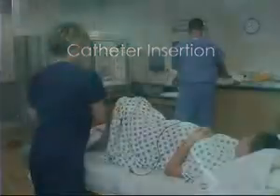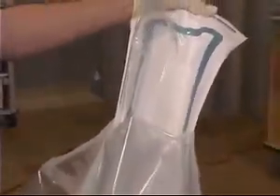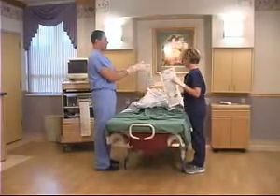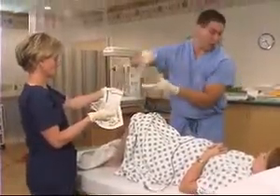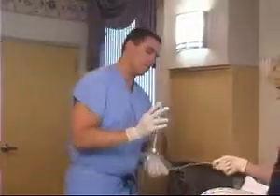Open the Koala package by peeling apart the clear plastic cover from the back of the package to the line below the phrase "Peel to here." This exposes the inner pouch that covers the catheter, the pouch within a pouch concept that was one motivation for the Koala product name. This packaging design provides easy access to the Koala while ensuring the catheter remains in a sterile environment. Remove the catheter from the package and insert according to instructions and hospital protocol.